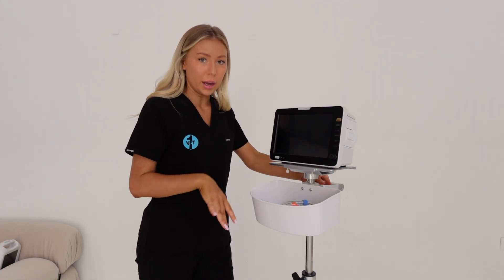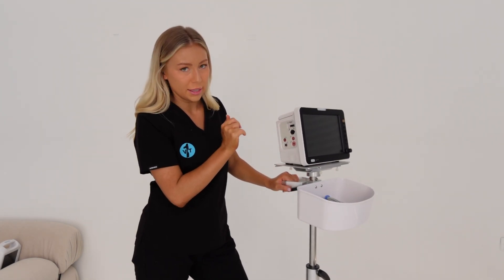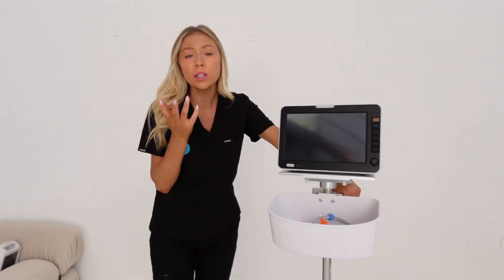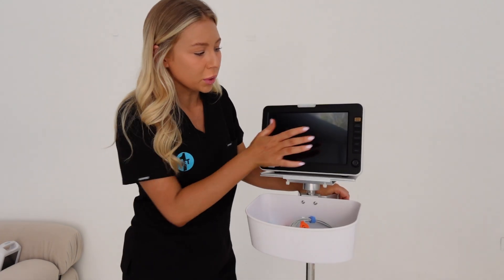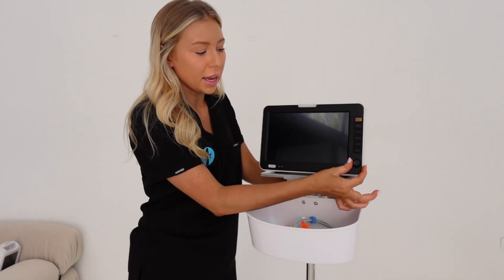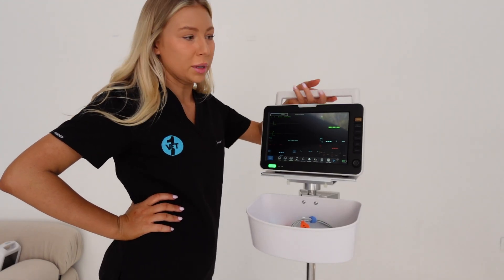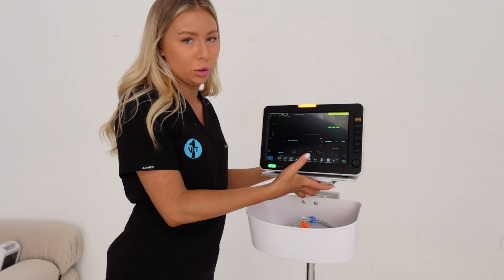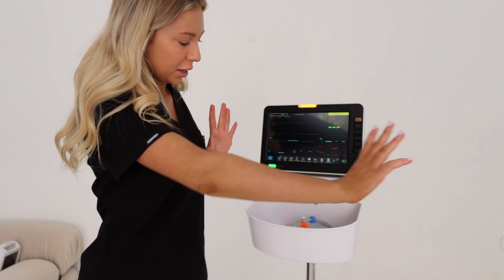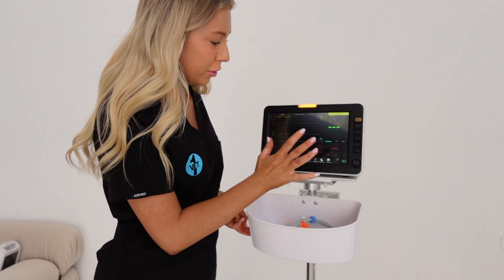This one is exactly the same monitoring-wise - it does temperature, blood pressure, SpO2, and ECG, and has the adaptability to add in capnograph, end-tidal CO2, which most clinics do and I would highly recommend. It is touchscreen but also has a couple of buttons on the side for navigation. It's got a nice big handle on the top and can adapt to the trolley. You've got a lot more screen space and more options along the bottom.